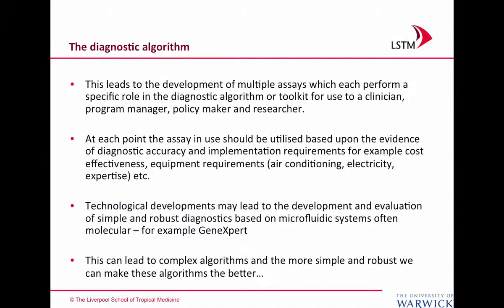This has led to the development of multiple diagnostic assays, and sometimes the diagnostic algorithms can get quite confusing and quite elongated. But I think we must always remember when we're talking about development of diagnostics, what a clinician needs, what answer do they need. We don't want to overcomplicate a situation. We're also thinking about program managers, policymakers and researchers. What answer do they really require?